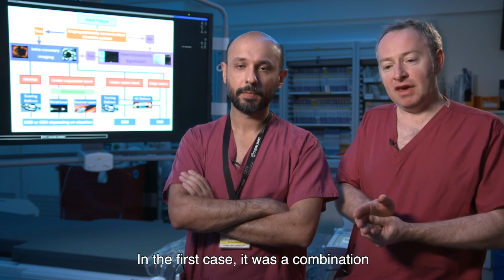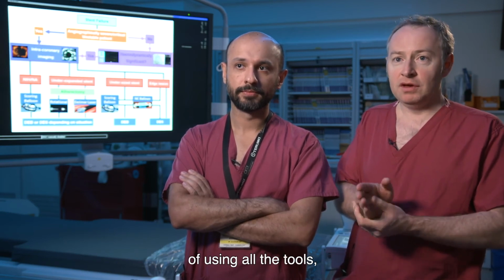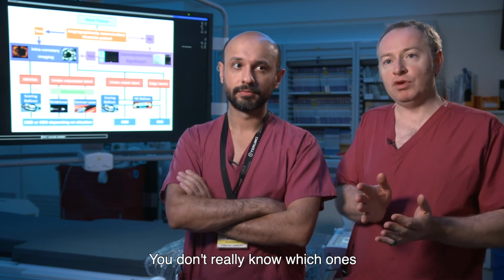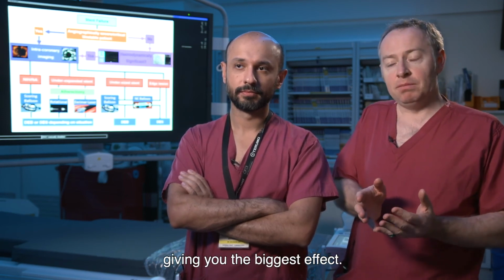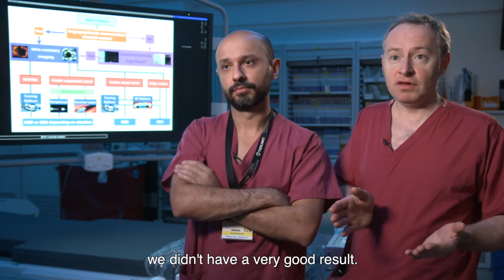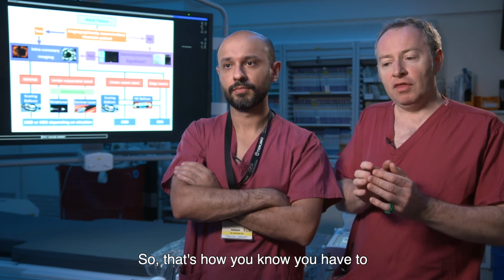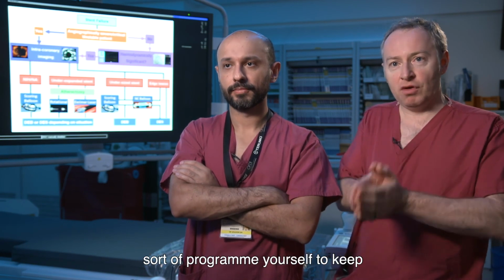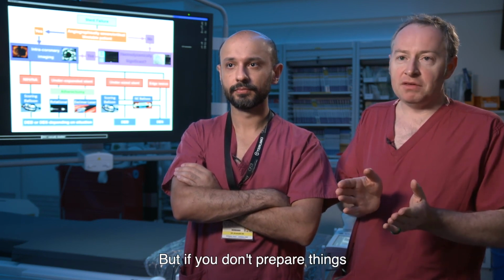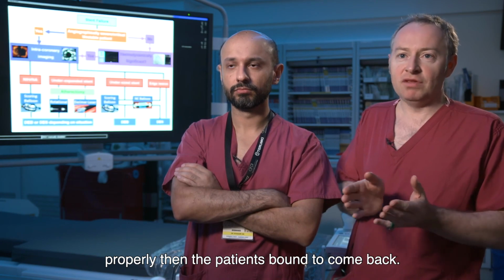In the first case, it was a combination of using all the tools: laser, angiosculpt, and non-compliant balloons. You don't really know which one's giving you the biggest effect. But we know from the previous case, where we didn't use those extra devices, we didn't have a very good result. So that's how you have to program yourself to keep seeking out which device to use. But if you don't prepare things properly, then the patient's bound to come back.